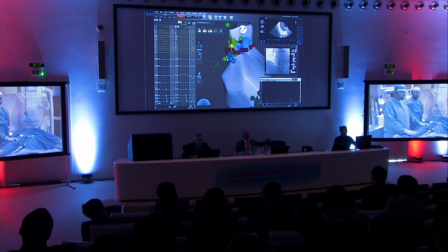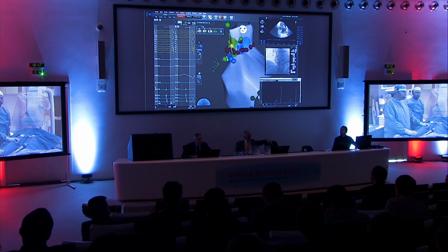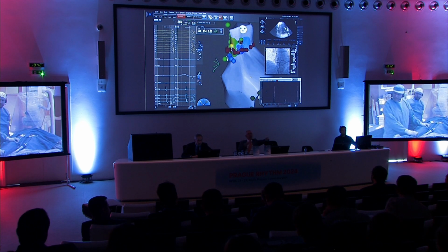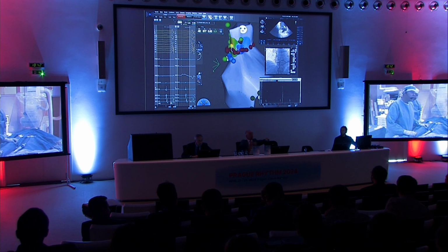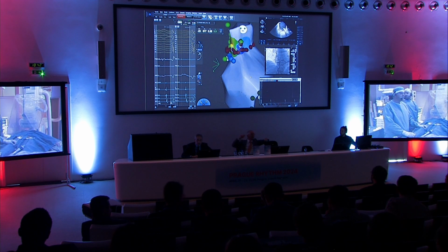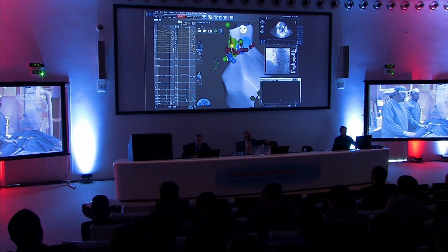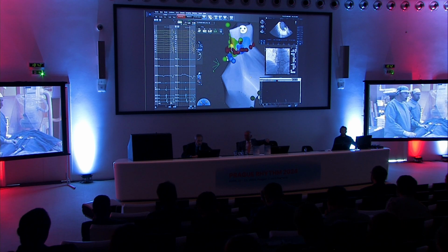It's the problem of the system. Yeah, because there is interference with Carto. So actually, its disappearance is because they have a switch. So you need to switch off, because by the delivery you can damage the things, right? Also, it could freeze the intracardiac echo image if you deliver. So it's a high voltage where you deliver.